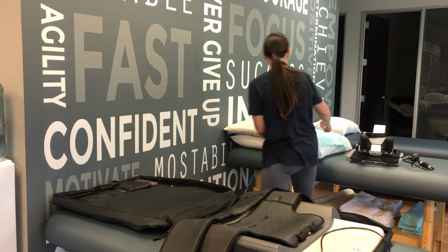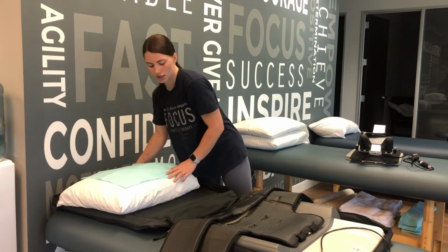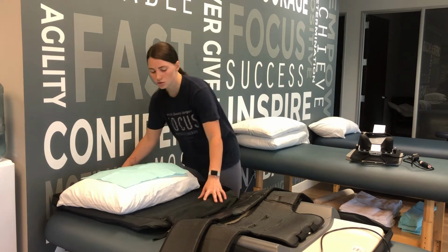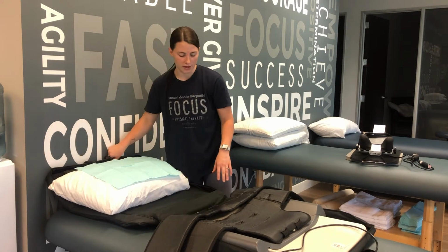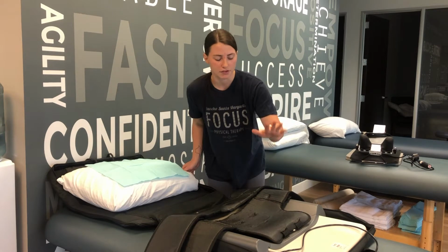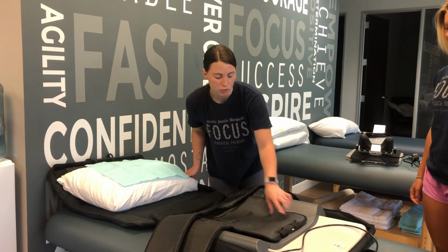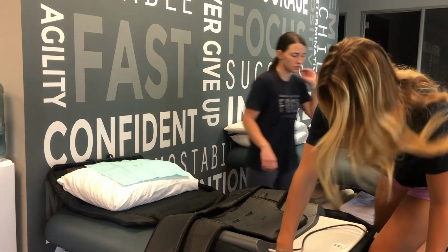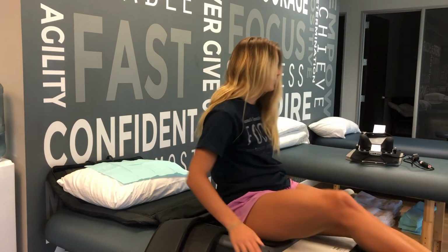I'm going to put a pillow here for the patient, and depending on how tall they are, you might scoot this up a little bit or scoot it down. We'll probably have it about right here. If you want to come over here, I'll have you sit. I always tell them to sit kind of right on this little square portion of the traction. And then you can lay back.